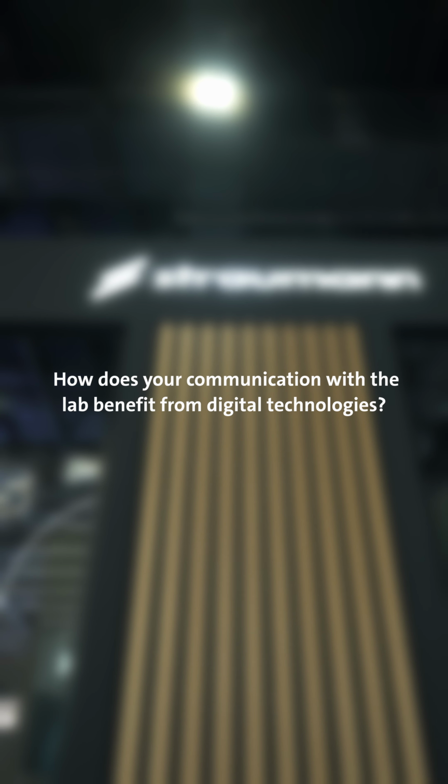So even communication with the lab, visual models, CAD/CAM technology has improved a lot. So patient, lab, dental communication, that has helped a lot. Initially, we do the CBCT and have the DICOM files, and then we have the intraoral scanner, so we have the STL file sent to the lab. The lab is supposed to have the same platform, or at least compatible software that can read all this information.